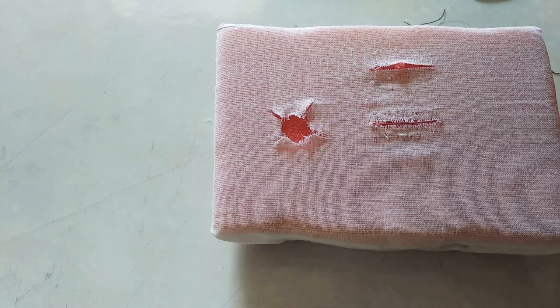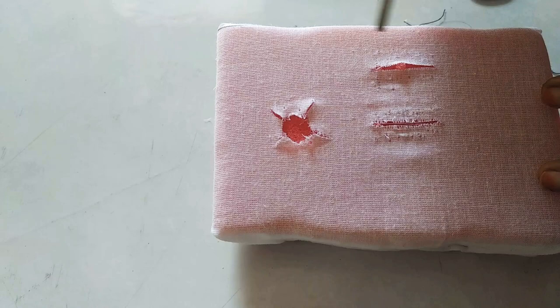In this video we will see about figure-of-8 suturing, which is especially important to close wounds after extraction — to control bleeding from the extraction sockets. You can see here this is the extraction socket.